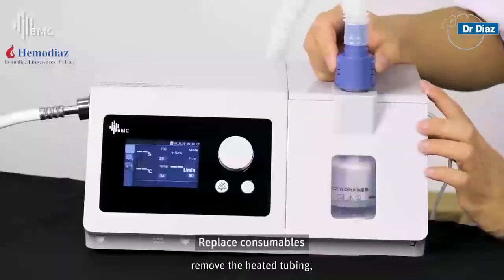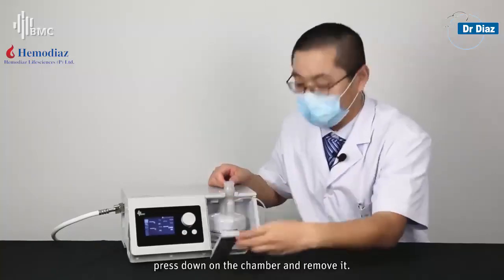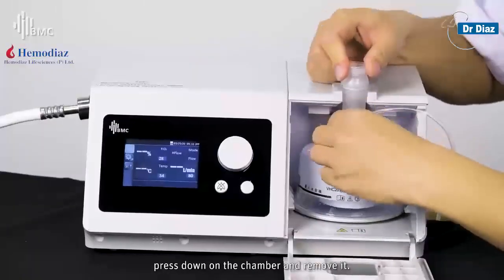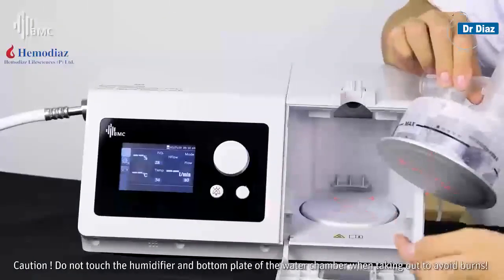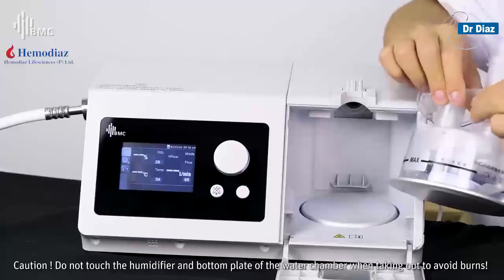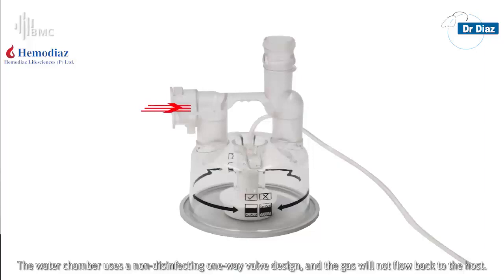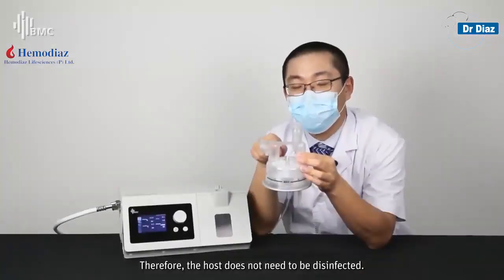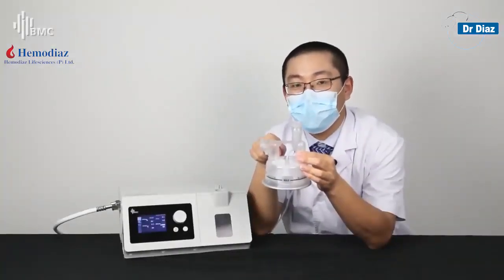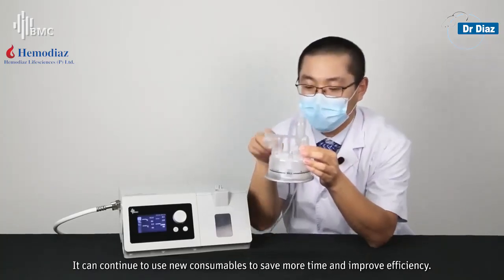Remove the heated tubing, open the water chamber cover, press down on the chamber and remove it. Do not touch the humidifier or the bottom plate of the water chamber when taking it out to avoid burns. The water chamber uses a non-contaminating one-way valve design so gas will not flow back to the host — therefore the host does not need to be disinfected. New consumables can be used directly to save time and improve efficiency.